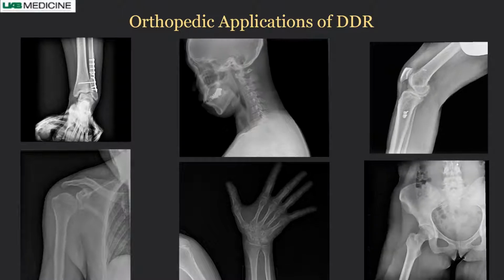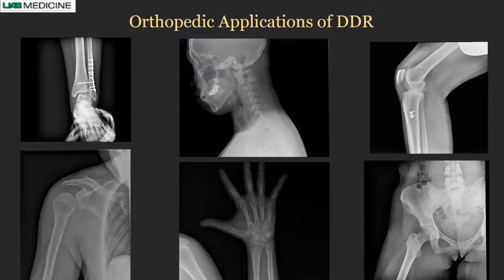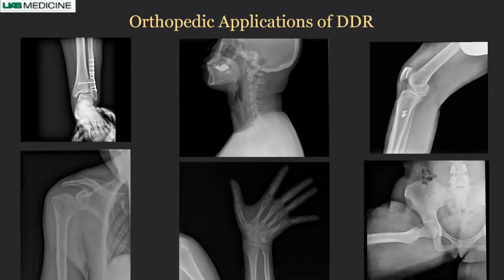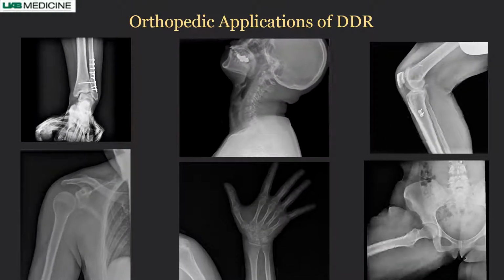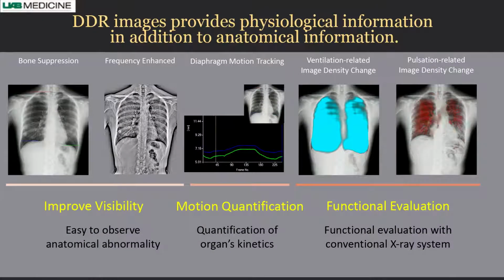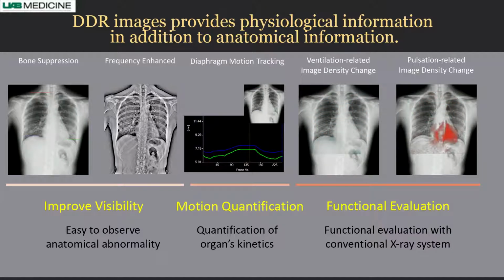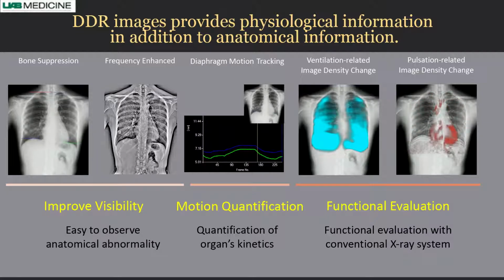So of course, you have a lot of other applications, you can play with these, all kinds of joints. Again, a lot of potential in post-treatment or looking at the joints. Well, it's not going to show you. I didn't do it. It automatically switched over to the next. But there is a lot of potential for bones too.